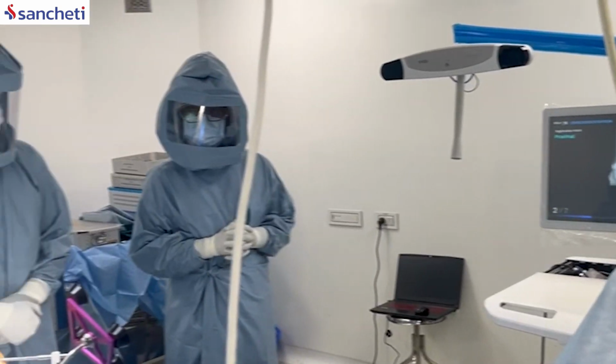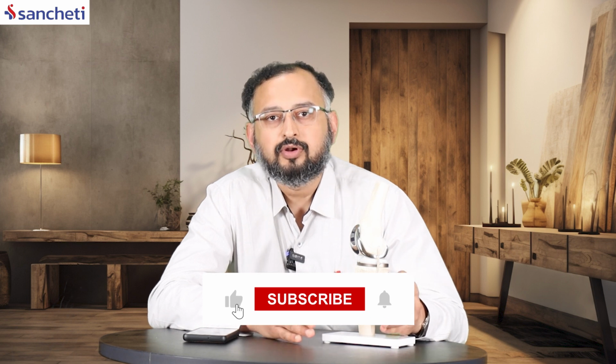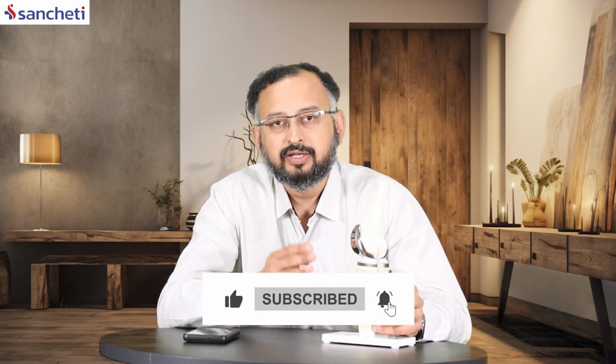We usually do these calculations just before the day of surgery, and that is how the planning of the implant fitting and the sizing of the implant is done. And I can tell you that we can have personalized alignment. If a patient has lived his life for 20 years and he's walking with a slight bend in his knee joint, I can't make it completely straight, because then it is going to make him a little unhappy. So with robotic knee replacement, we can achieve personalized alignment, and in recent trends, personalized alignment has been shown to have better outcomes in terms of patient satisfaction.